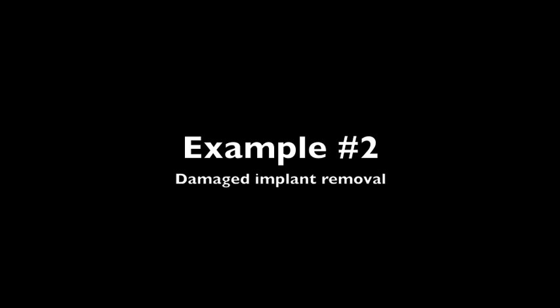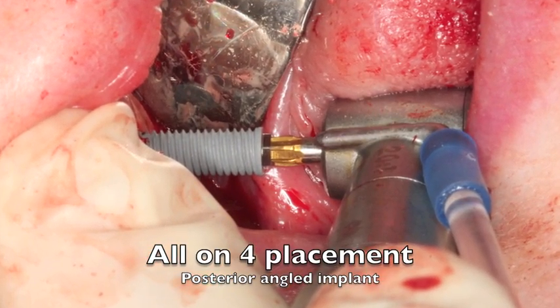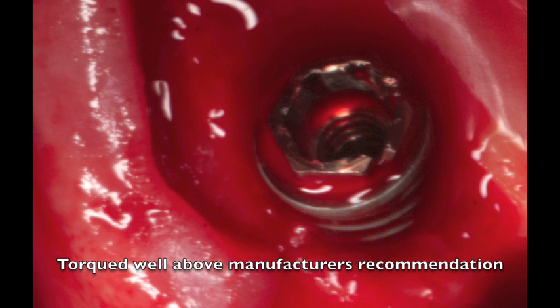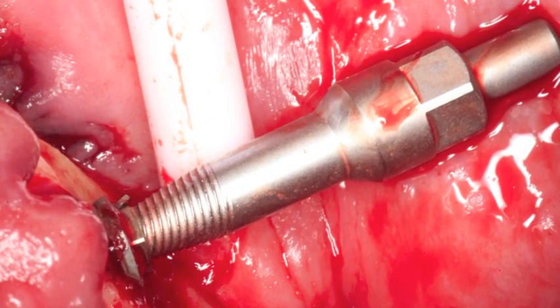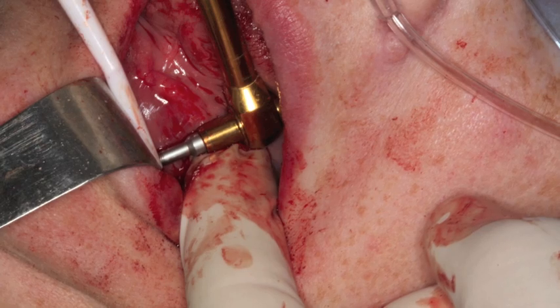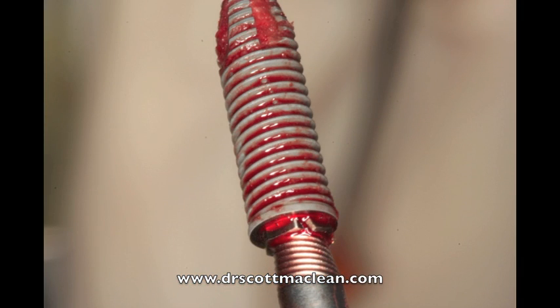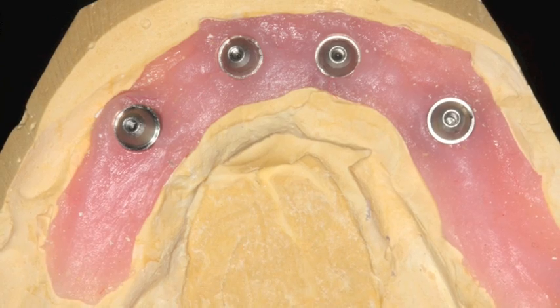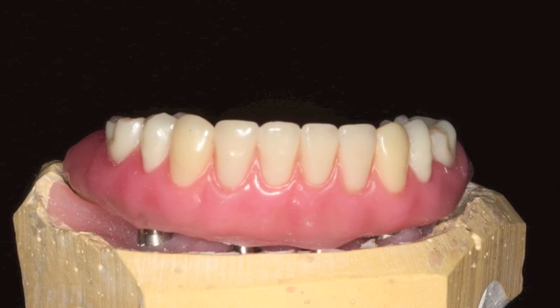Example number two is a damaged implant which needs removal. During an all-on-four procedure, I was torquing down an implant and one of the posterior implants had a little too much pressure put on it and the top of the hex was damaged — hooped out and fractured. We can't leave this damaged. Take the implant removal tool, do the same procedure as the first case, place it inside the implant, screw it backwards, and we're able to unscrew the implant. This implant isn't even osseointegrated but it's in there pretty tight and I can't fit anything over the damaged hex. You just unscrew the implant, go back, place other implants, and finish the all-on-four case.